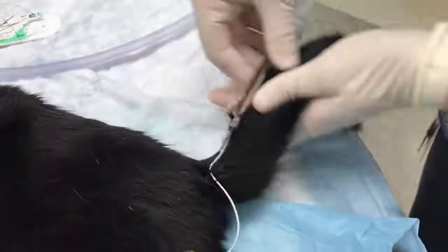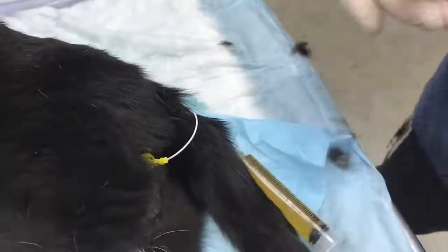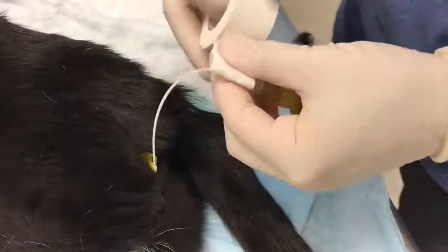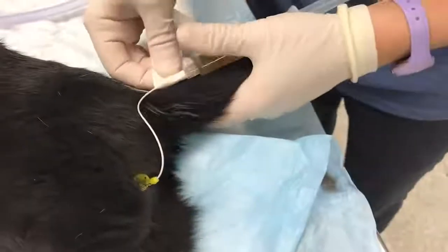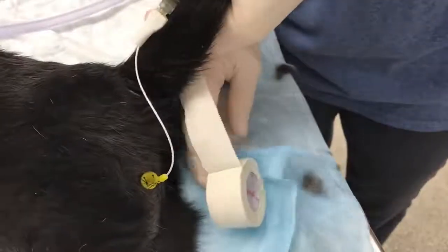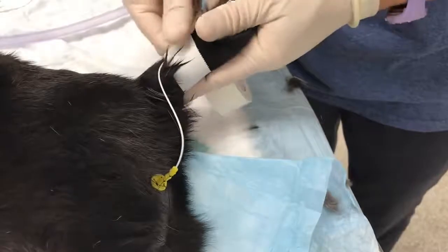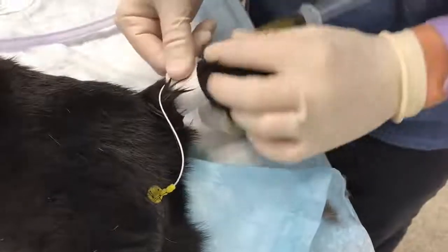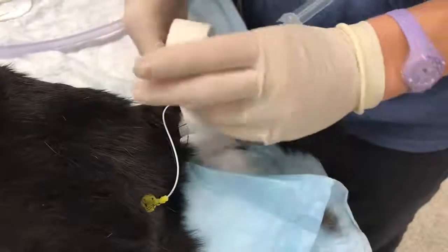Flex the tail dorsally to ensure that there is enough slack in the catheter to prevent it from pulling on the prepuce. Then wrap the white tape around the catheter and then around the tail of the cat to affix the catheter to the tail of the cat. The catheter should be taped on the dorsal aspect of the tail.